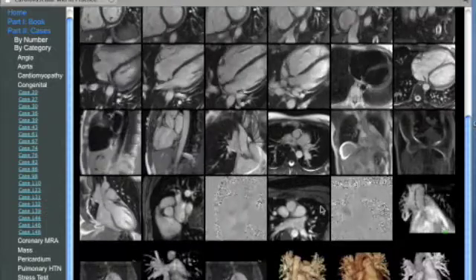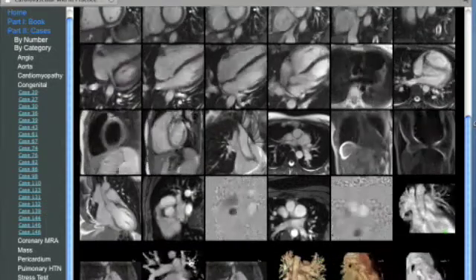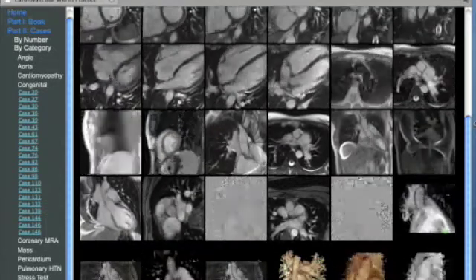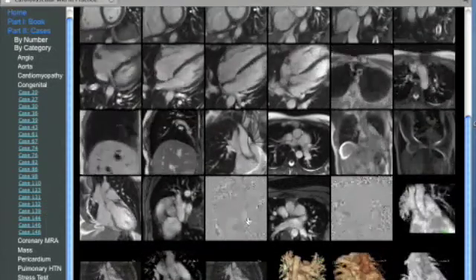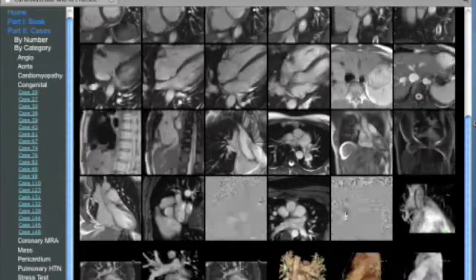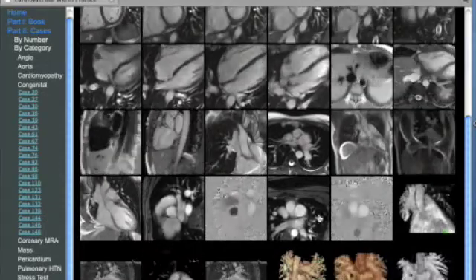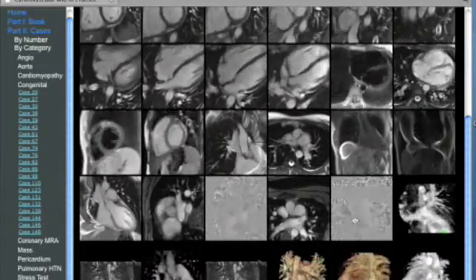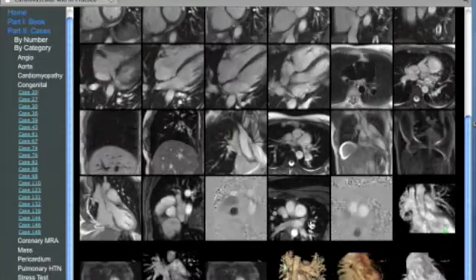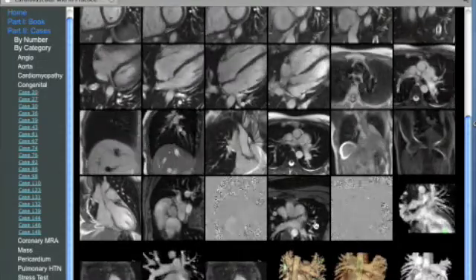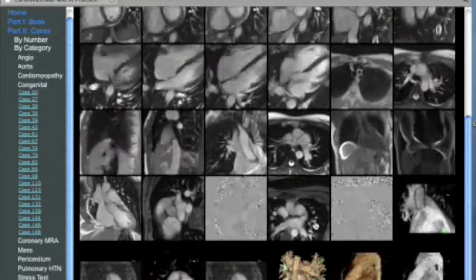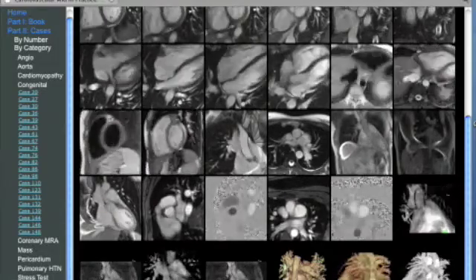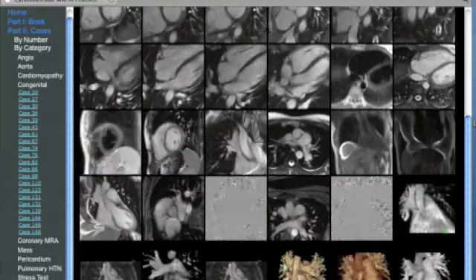MR angiography was subsequently performed along with flow analysis through the pulmonary and aortic arteries. These demonstrated a QP to QS ratio of 1.5 to 1, indicating a relatively mild to moderate shunt.